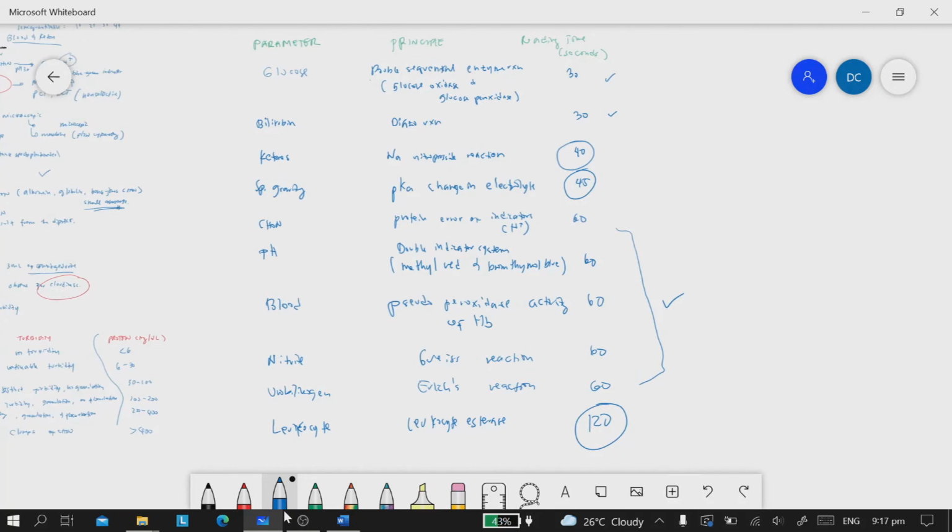So, I would recommend that you memorize this by heart. Especially with urinalysis correlation and chemical analysis, mo dyan siya mogawas, especially with case studies. I-correlate niya siya sa imuhang microscopic na kuan. For example, no, leukocyte esterase taas siya if there is infection, bacterial infection. If there is hepatitis, musaka yung bilirubin, and so on and so forth.